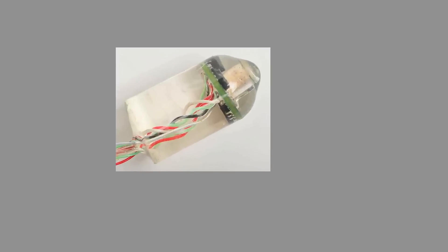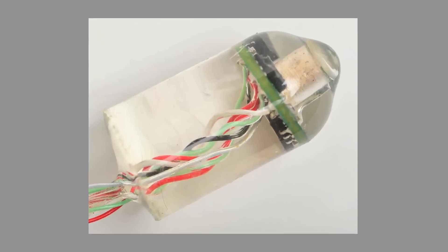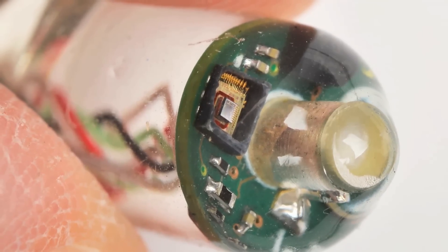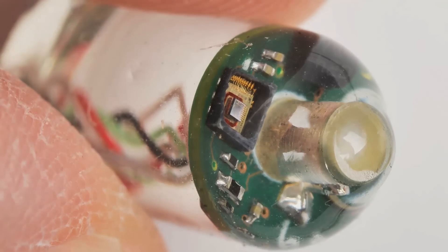Up to now, we've focused on building a sensor small enough to swallow and developing a signal processing algorithm that can turn body sounds into heart and breathing rates. The next step is to build an entirely wireless device comprised only of FDA-approved components that can be ingested, and we'll be testing these devices to collect heart rate, breathing rate, and core temperature.